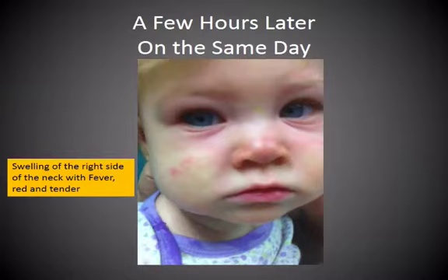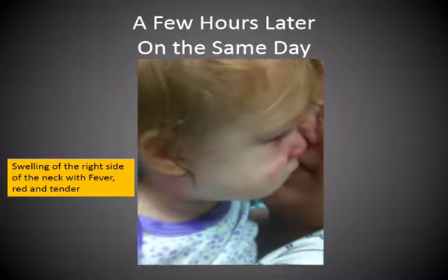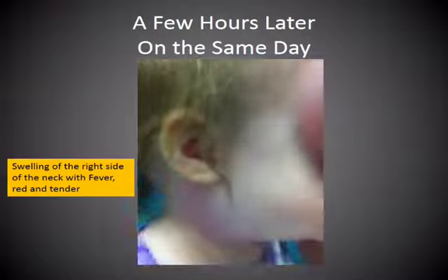Now, on the same day and just a few hours after the last patient we just saw, I had this young lady come into the emergency department. Those of you who do pediatrics know this look. That look is, you're not coming near me with your hands or that ultrasound machine. If you look carefully at the video, you'll see that there's a red area under the ear, under the jaw on this young lady. And indeed, she did have a fever, and her chief complaint was swelling under the jaw for a day or so.